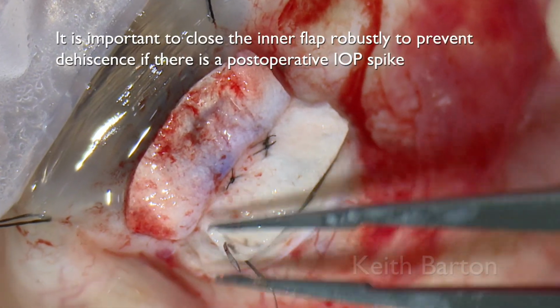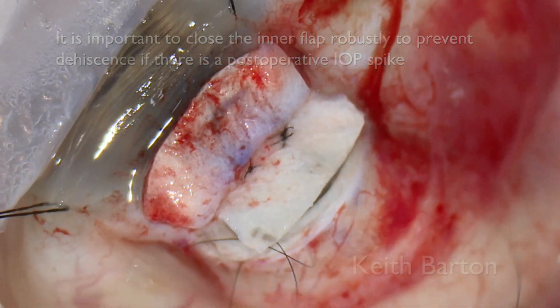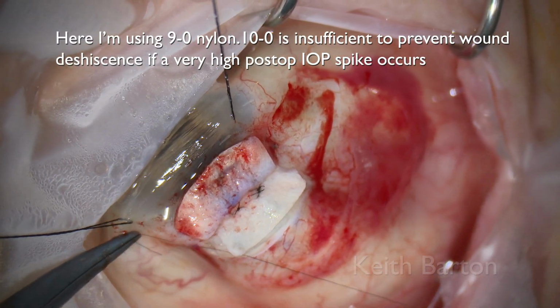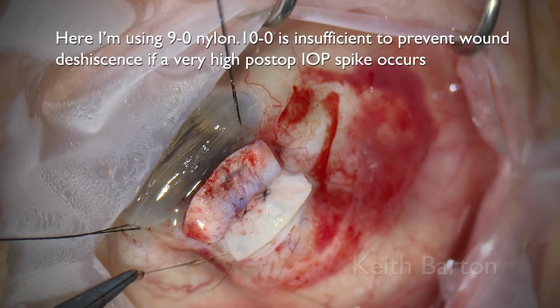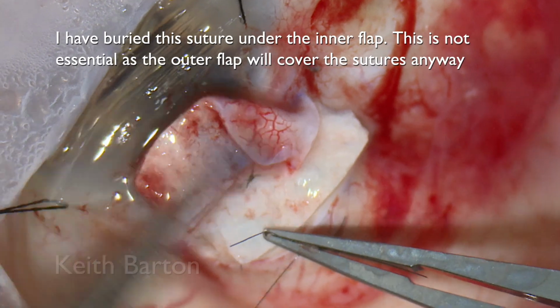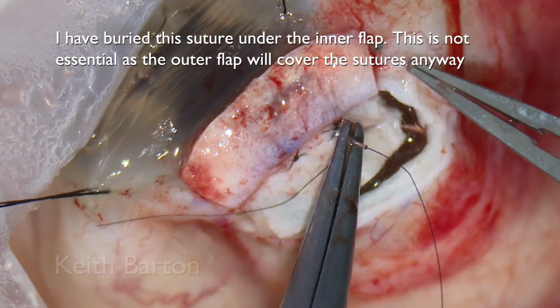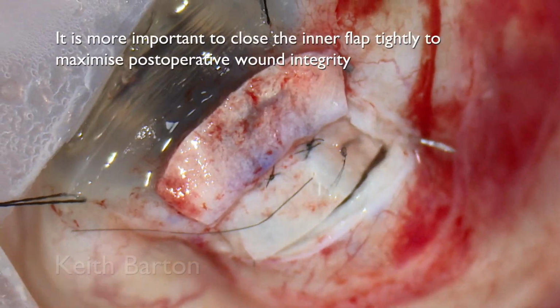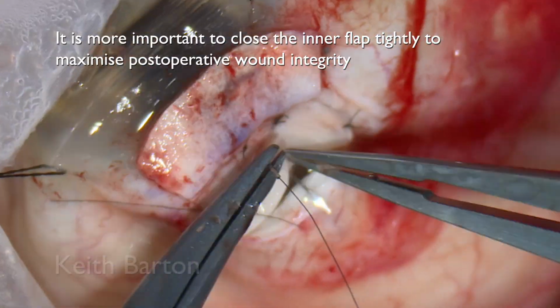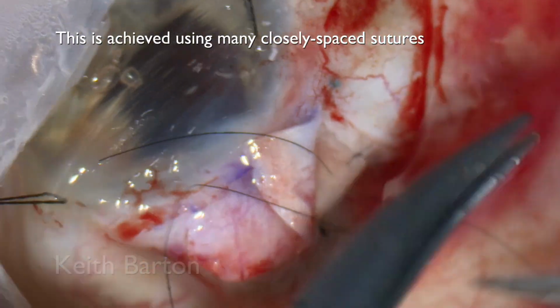It is important to close the inner flap robustly to prevent dehiscence if there is a postoperative IOP spike. Here I'm using 9/0 nylon. 10/0 is insufficient to prevent wound dehiscence if a very high post-op IOP spike occurs. I have buried this suture under the inner flap. This is not essential as the outer flap will cover the sutures anyway. It is important to close the inner flap tightly to maximize postoperative wound integrity. This is achieved using many closely spaced sutures.